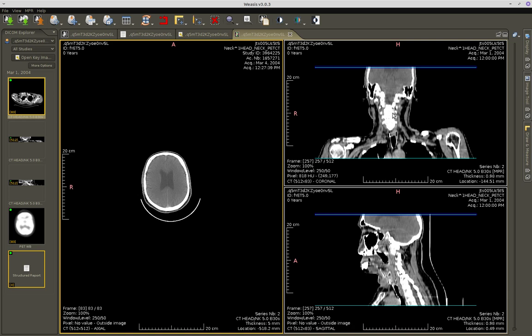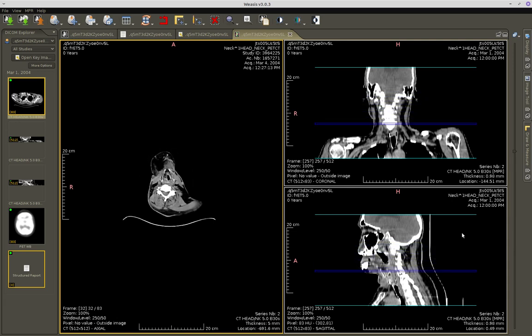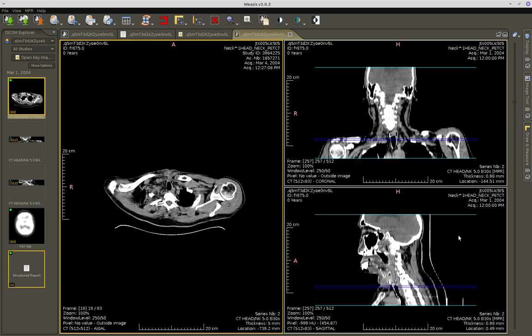The main shapes you can at least recognize as anatomy, but the one at the bottom is very difficult. This area of the sinus, all that stuff looks weird, and all the teeth here and the chin just look weird.